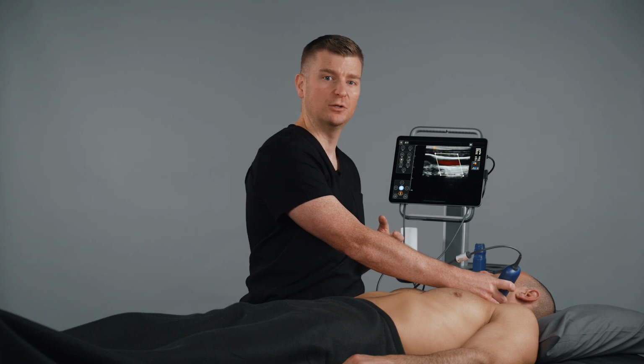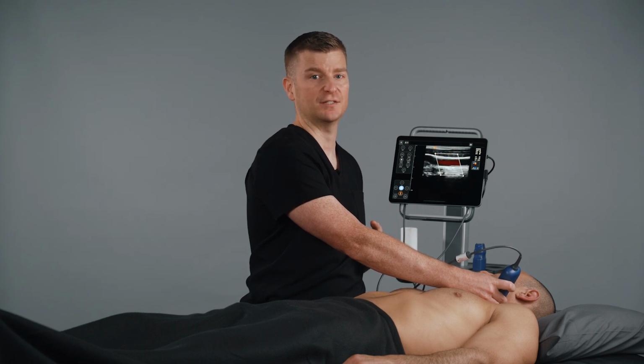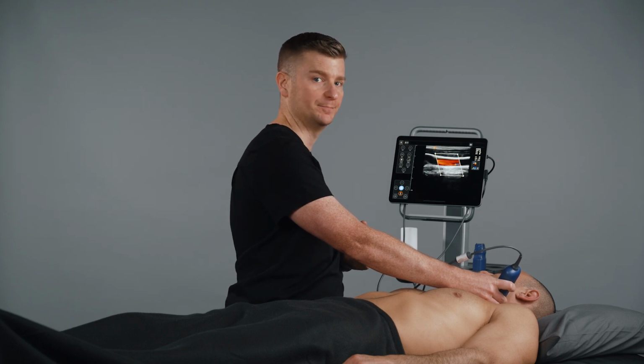Since CPD shows the strength of blood flow rather than direction, it's particularly useful for assessing flow in smaller vessels or structures like the thyroid, where traditional Color Doppler might be less effective. For example, it is helpful in detecting tendon inflammation in MSK scanning.